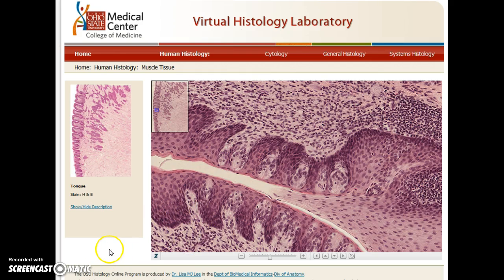All right, I hope that helps you understand the histology of some of the nervous system structures.